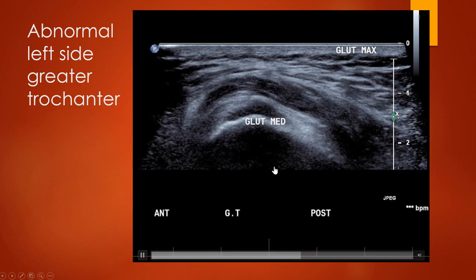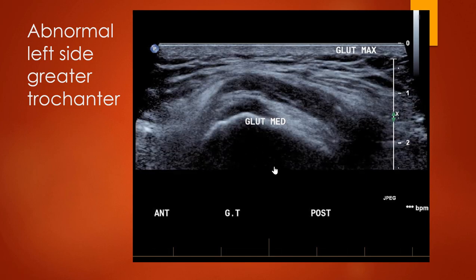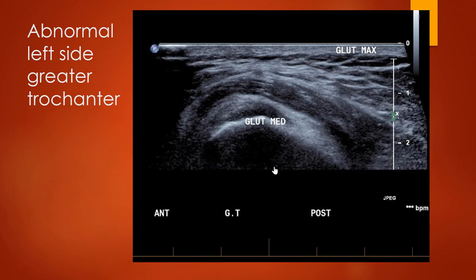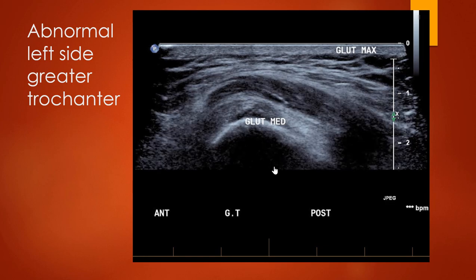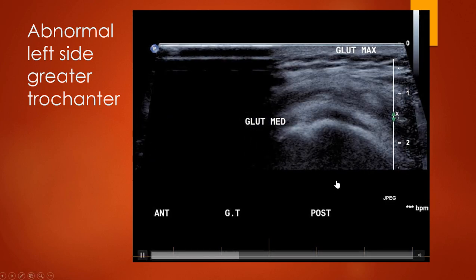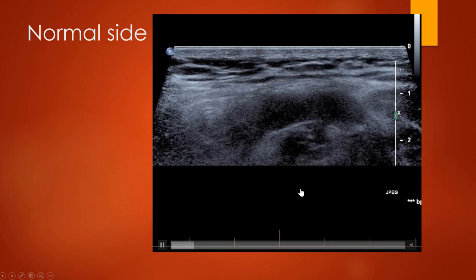And in this case, it wasn't actually that there was any tendinopathy of the medius tendon underneath. They had an MRI, it was completely normal on MRI, just had this mechanical snapping sensation, which is highly annoying during his competitive sport. This is his normal side.